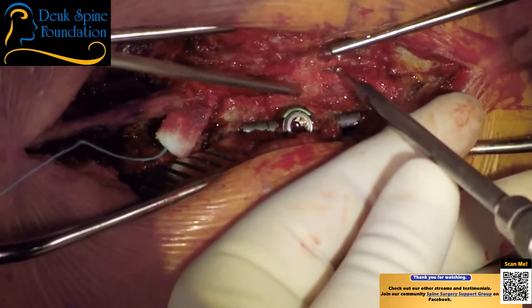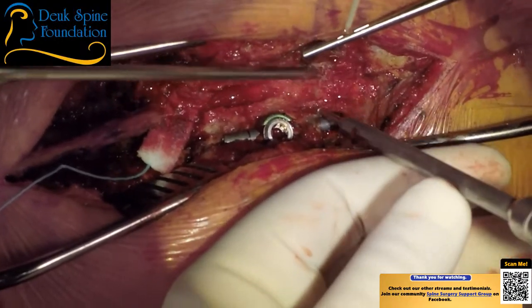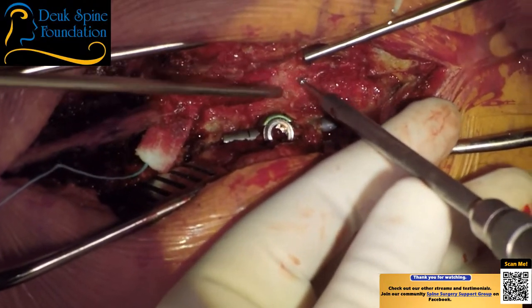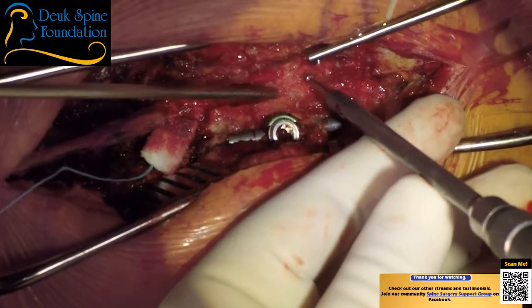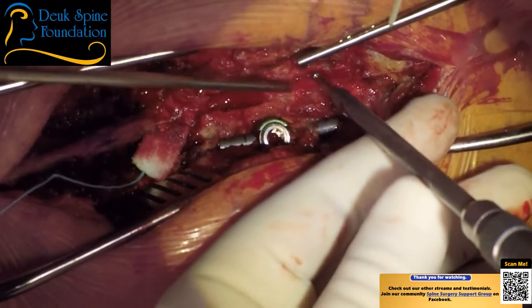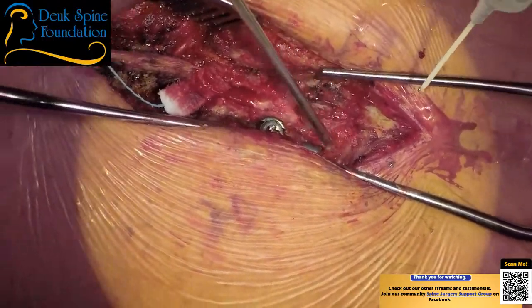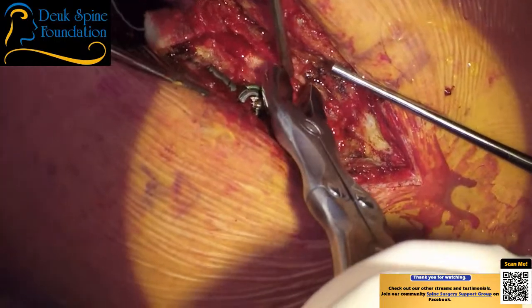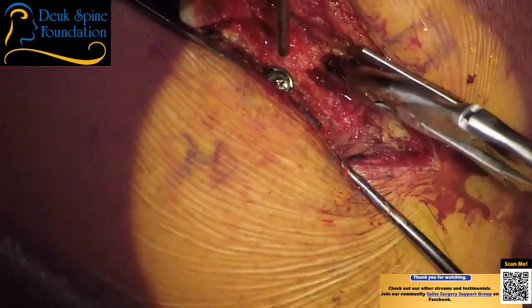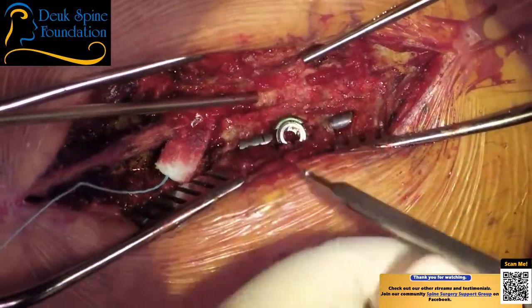This is the lamina. We're doing a laminectomy. So obviously the bottom of here is going to be the spinal cord, which I don't want to get into. In case you're wondering what get into means, it means the same thing you think it means. It means enter it. We don't want to enter the spinal cord ever, unless we're taking a tumor out of the spinal cord, which we're not doing today. We're just unpinching it from the back. So getting into it is not something we envision happening today.